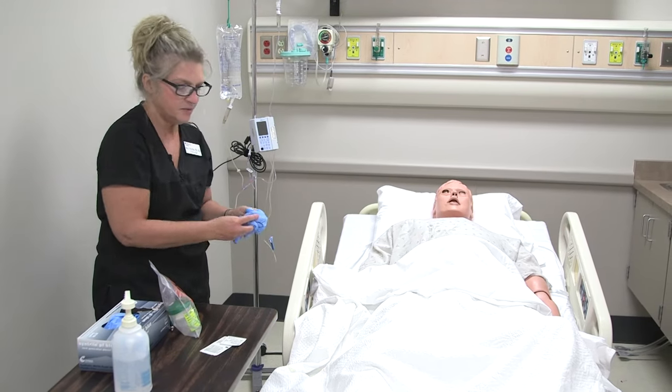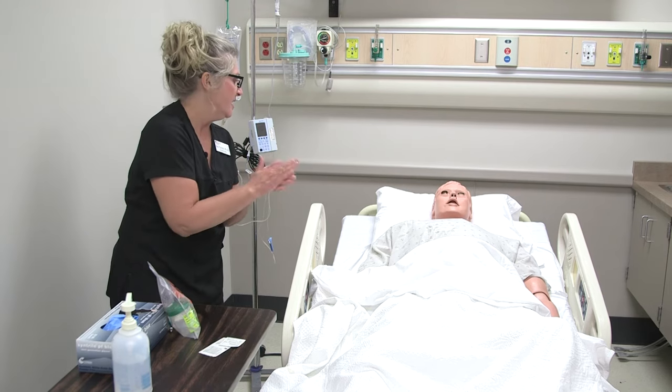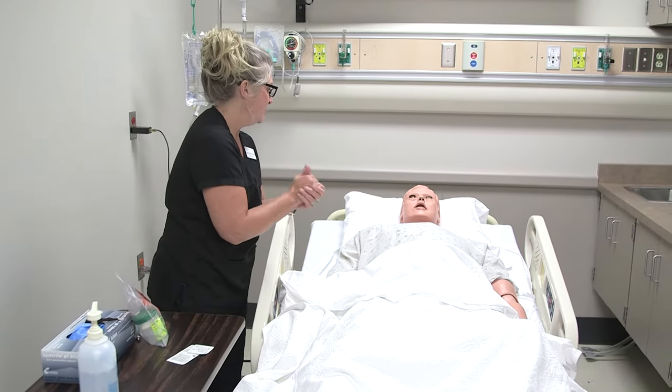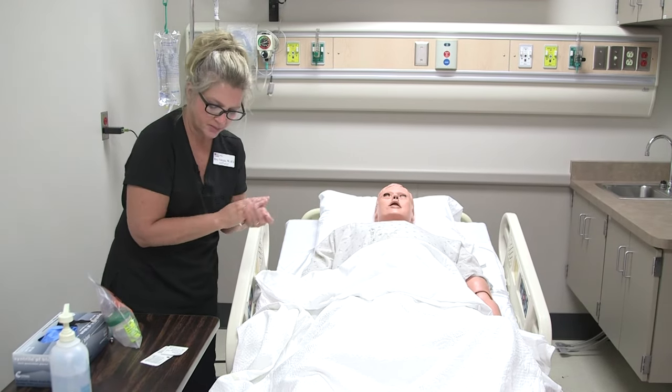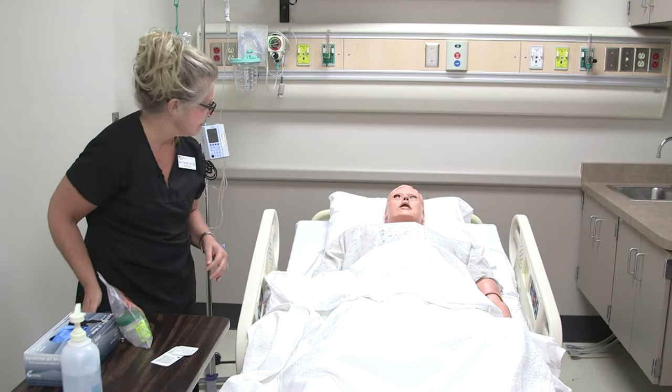Side rails are up, bed locked and low, call light is in reach, tray table is in reach. Ask him if he needs anything before we leave. Tim, how are you doing? Do you need anything before I leave? Well, let me know if you do — I'm going to step out now and be back in about an hour or so, and I'll get this to the lab.